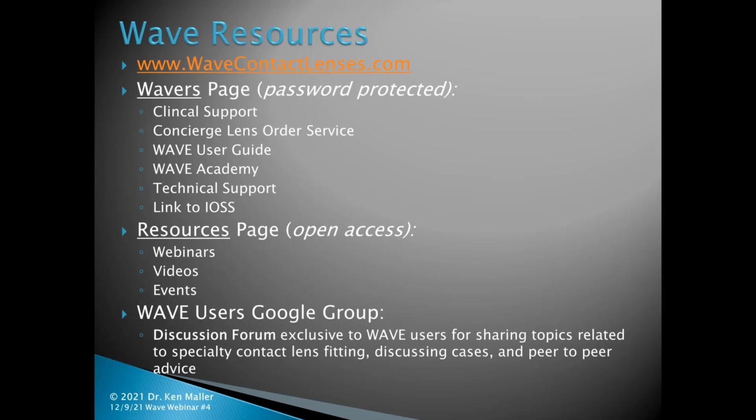But because this was a very established wearer for many, many years, I went with an R-Sym on that lens to make certain that I was going to get enough movement of the lens on that particular cornea, because I've learned from experience, and I've been burned enough times, that you don't take an established wearer and put them into a very well contoured lens. No good ever comes of it whatsoever.